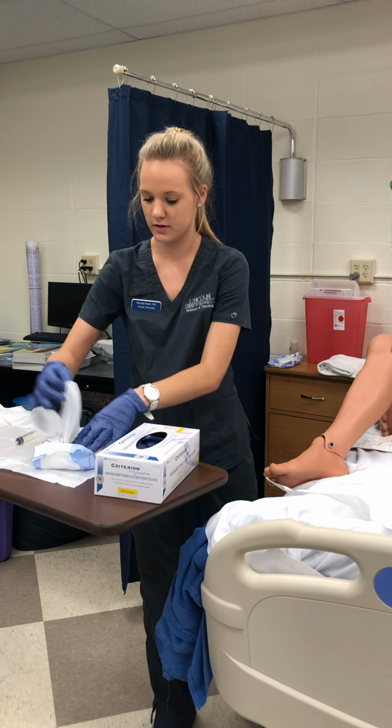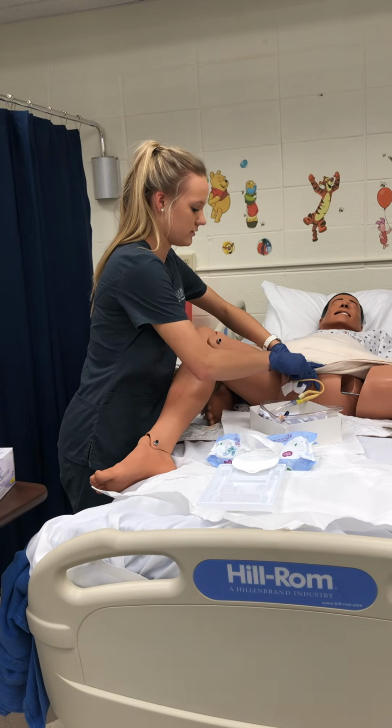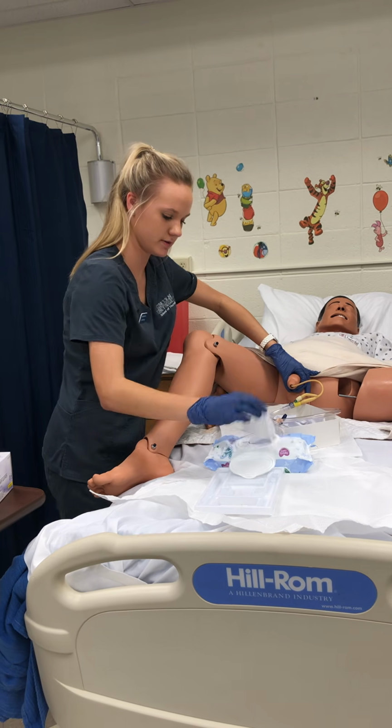I take my wipes, just like I did the first few times, and I would start at the top and I'm gonna work my way down, cleaning it all up.